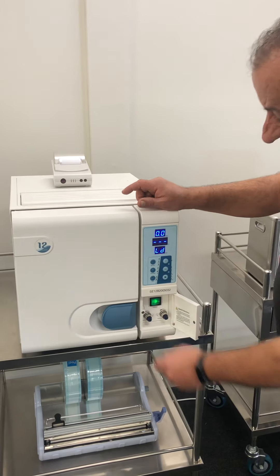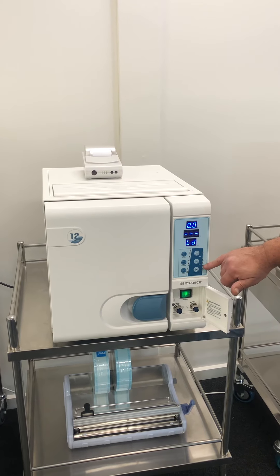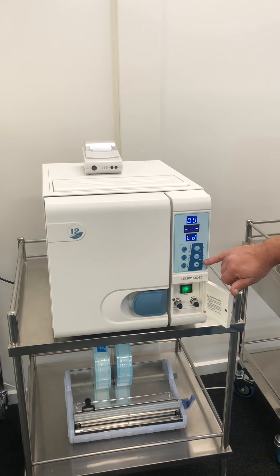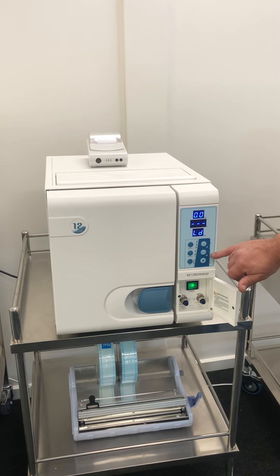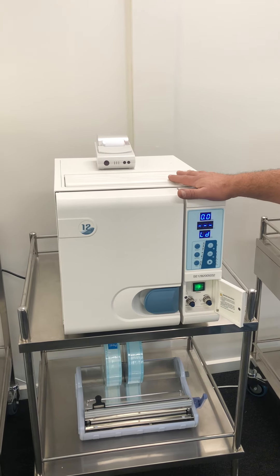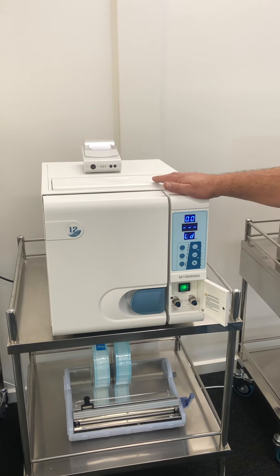The machine has got sensors. It will tell you if it needs water, if it needs to be drained, and also if you've put in tap water or bad water. So it's very important that the water light comes on for those three reasons.